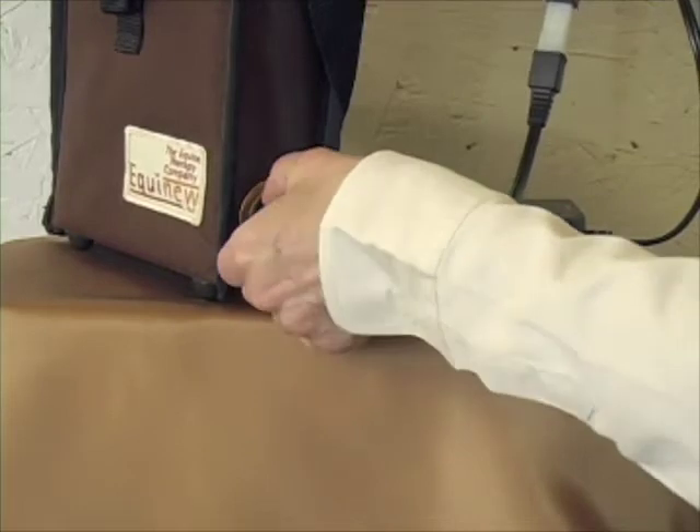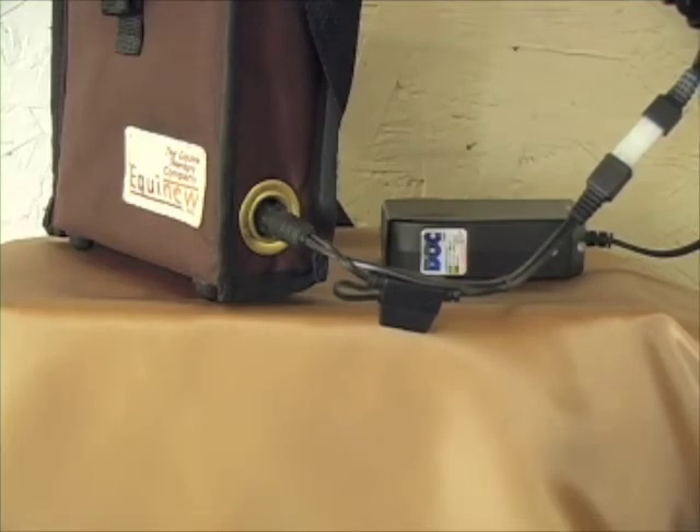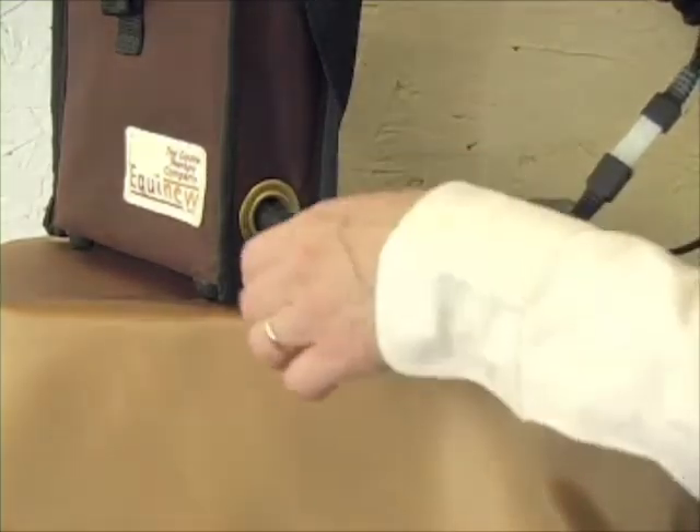When charging the battery, turn the system off. The battery cannot be overcharged; however, it is advisable not to leave the charger plugged in longer than 12 hours.